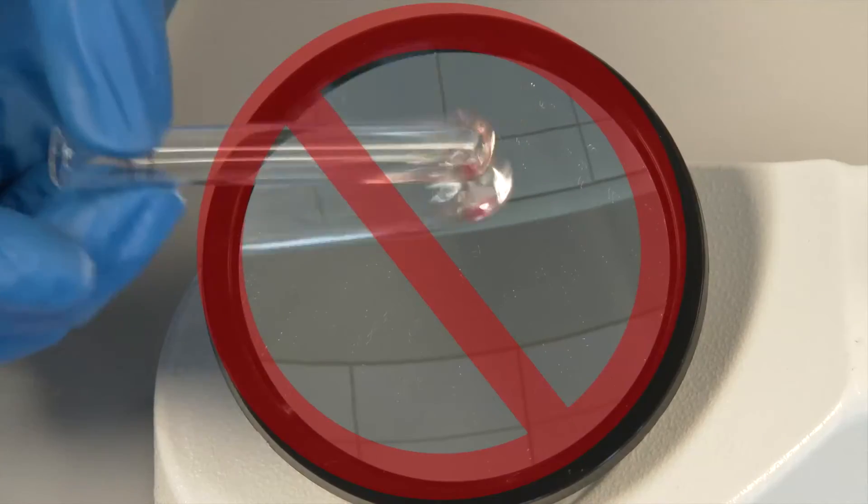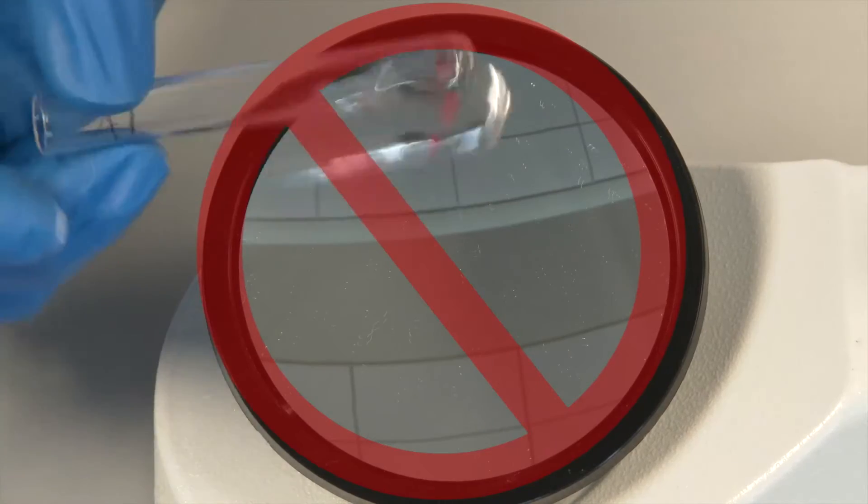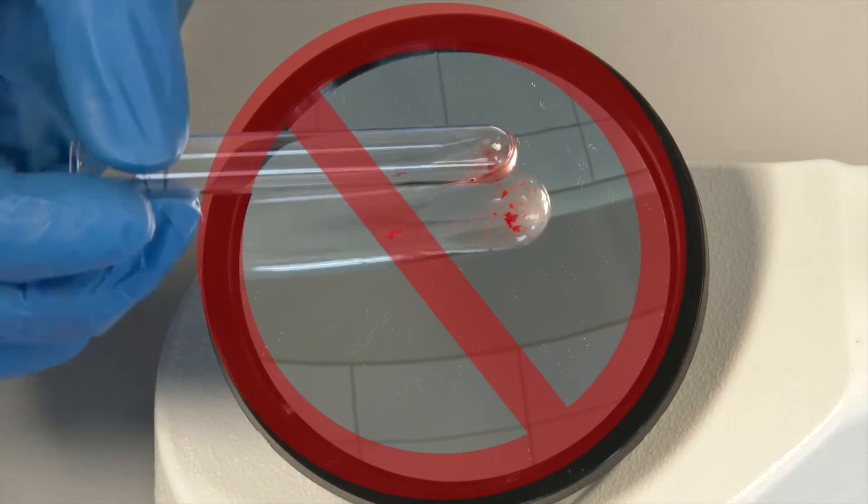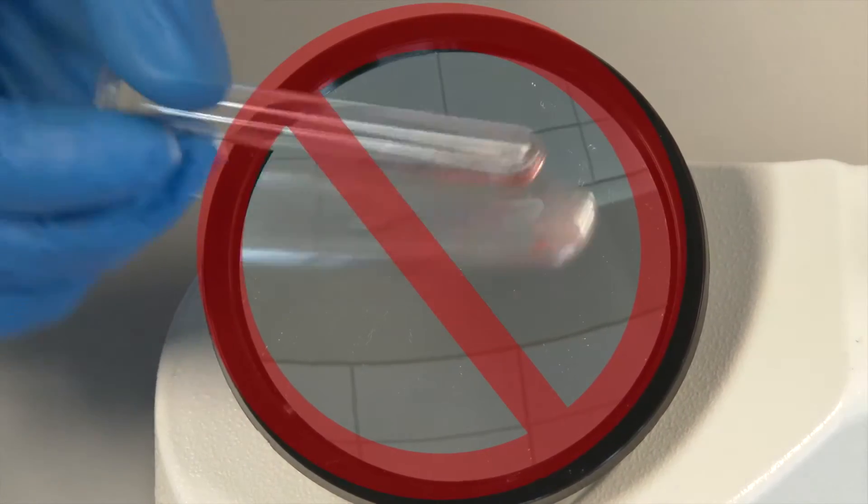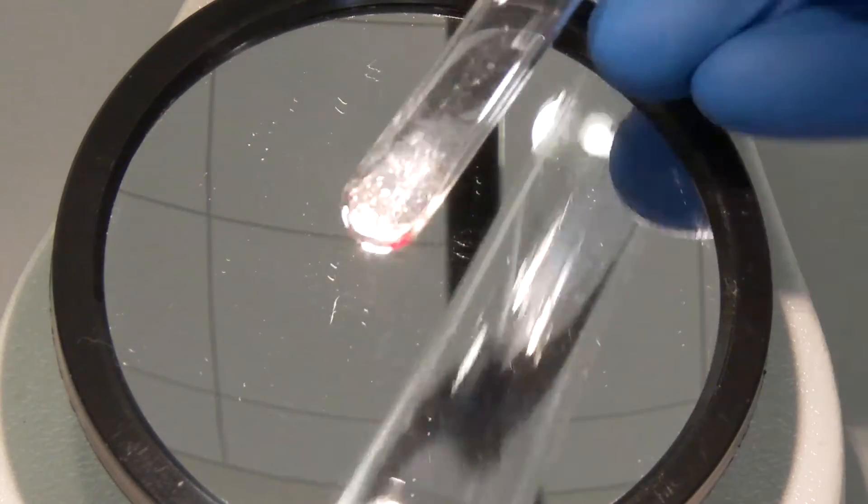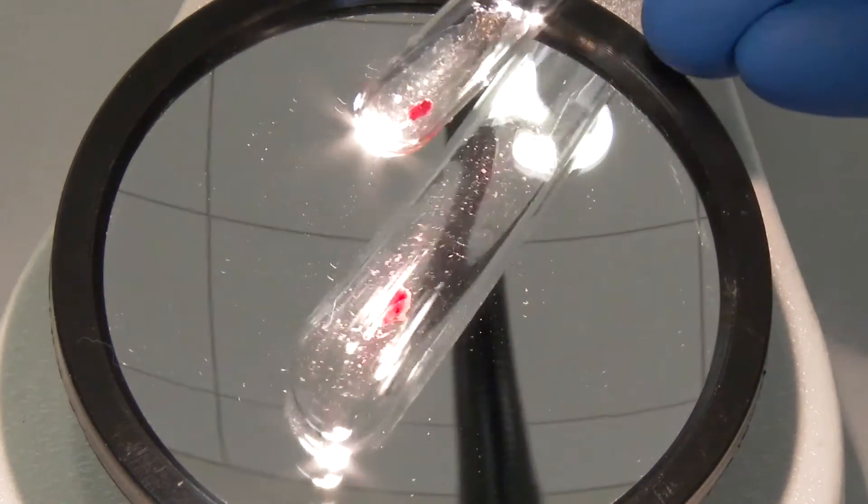Great care should be taken when shaking the test tubes because shaking too hard can cause reaction strengths to be less than expected or even cause a false negative result. Pay close attention to how the cell button comes off of the tube.